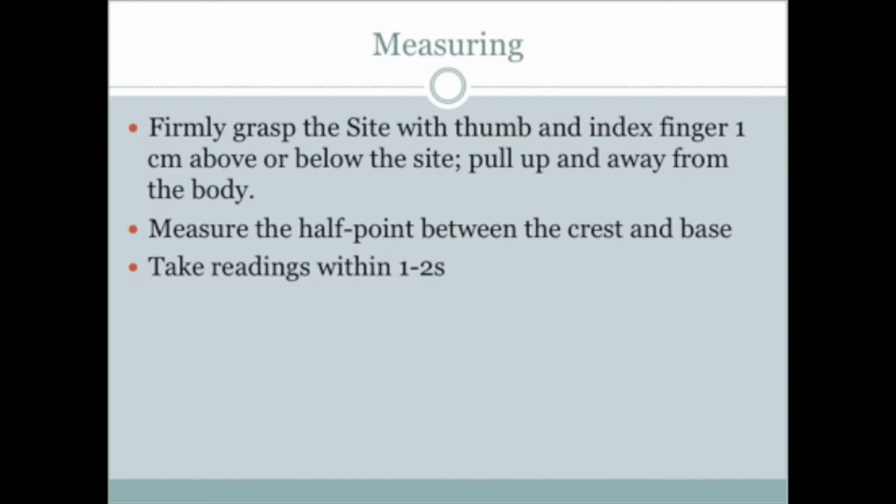To take a skinfold measurement, firmly grasp the site with the thumb and index finger, 1 centimeter above or below the site. Pull up and away from the body. Measure the halfway point between the crest and the base and take a reading within 1 to 2 seconds.